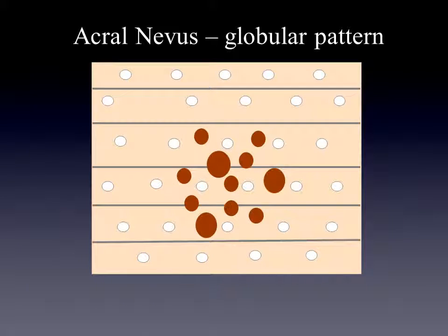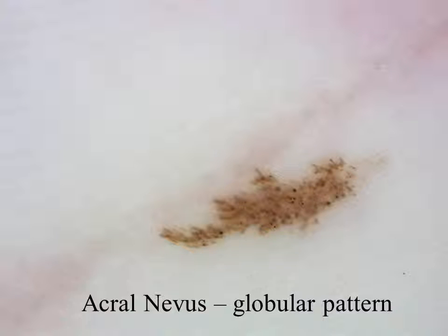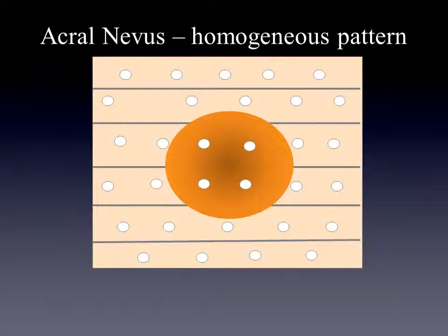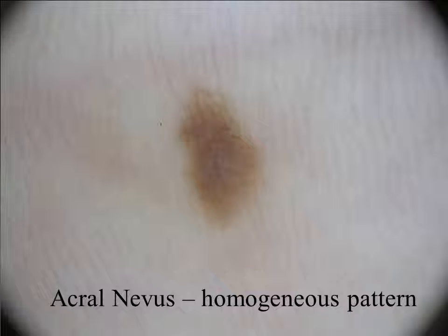The next pattern is the globular pattern, which can also be present in an acral location. Here you have an example — we see the globules along the ridges and the furrows. Finally, we also have in an acral location a homogeneous pattern. Here you see an acral nevus on the palm showing a homogeneous pattern.